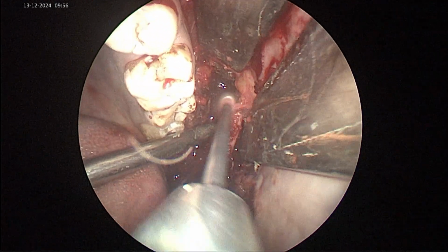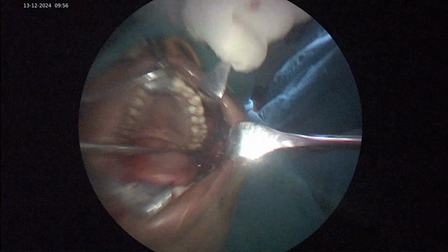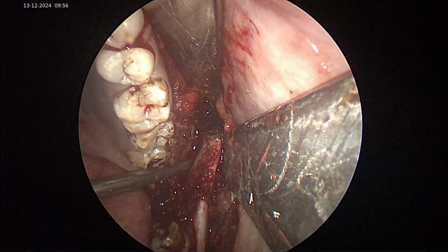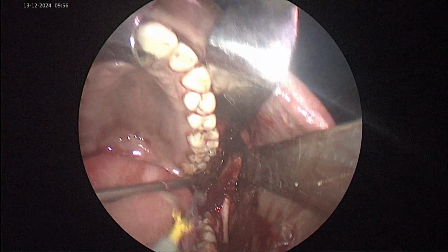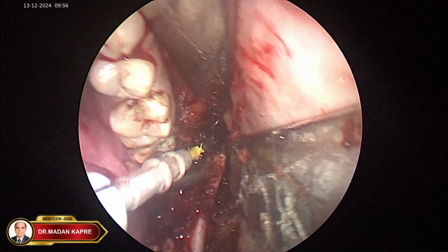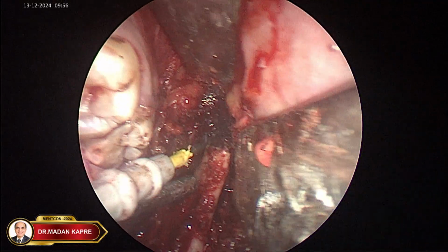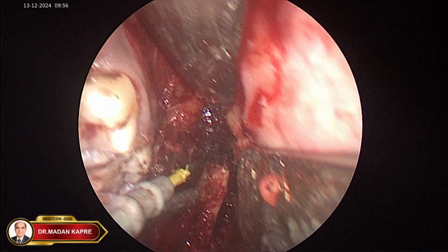Create a space there, yeah, that's right. And see, when you do that, you find something else. Can I have the cautery? You again find some fibers. If you see those fibers, ensure that you remove them. Because if you don't take those fibers down, you still will not get the mouth opening that you desire.